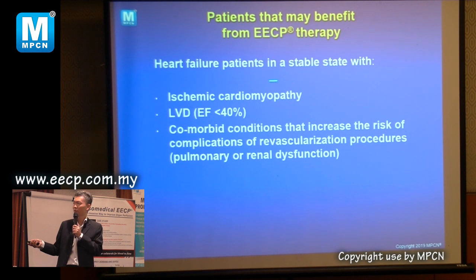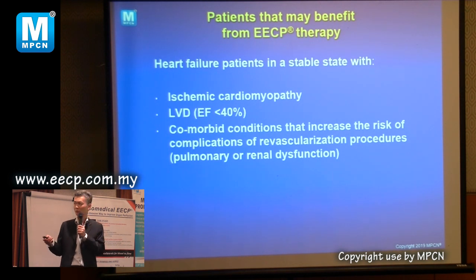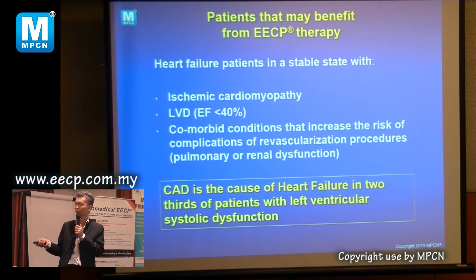So heart failure patients can be treated. As I said, you have to make sure that the heart failure is not a wet heart failure, not water in the lungs. So it must be dry heart failure. Then this will help them. Just now I said the most common cause of heart failure is blockage.